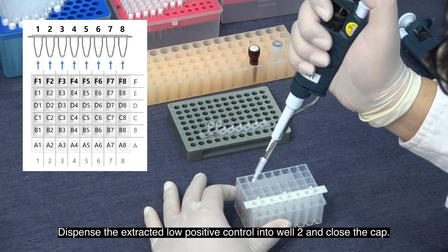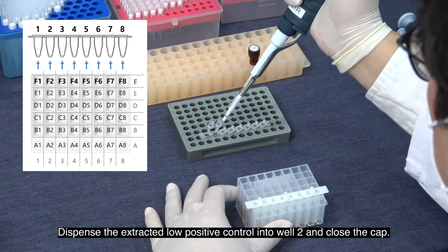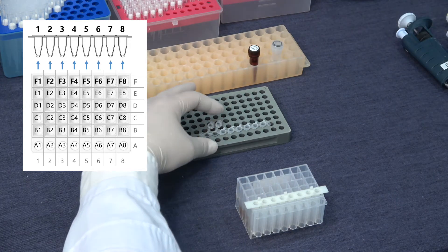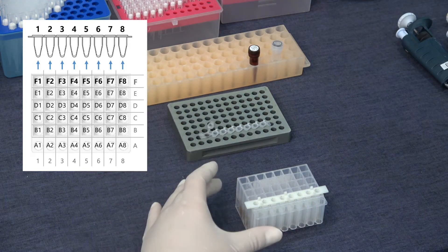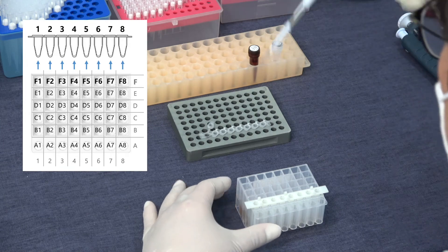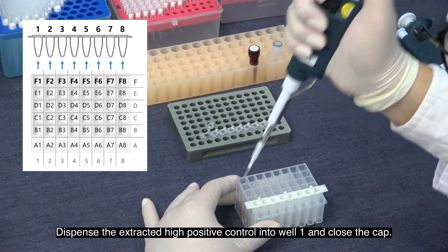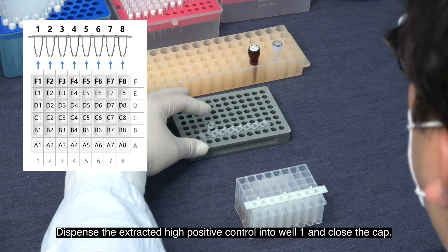Dispense the extracted low positive control into well 2 and close the cap. Dispense the extracted high positive control into well 1 and close the cap.